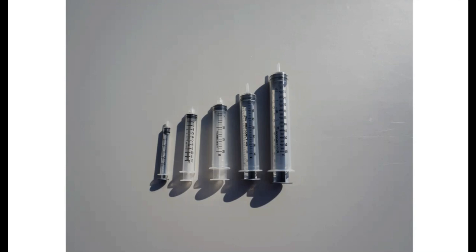And so that's where that big 60 cc syringe comes in, is you can pull all that up in one syringe. Now, you're not going to give it all in one location. The general rule of thumb is no more than 10 cc's in one location unless the label says differently. And so if we're giving 45 in this situation, we would want to give that in 5 different places on the neck of that animal. Since we're giving the same product, we can put one injection and then another one below it. If I was giving vaccine, I wouldn't want to put one vaccine and then another vaccine below it because I don't want them running together potentially there. So that's something to think about. But that's where those 60 cc syringes would come in handy.